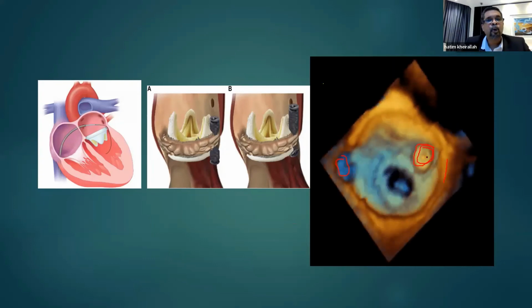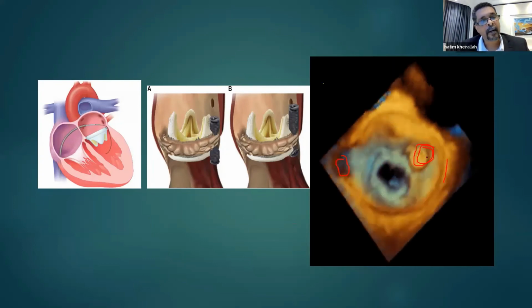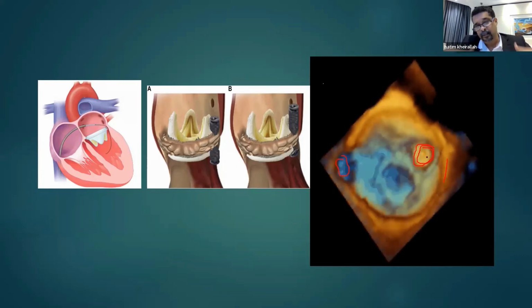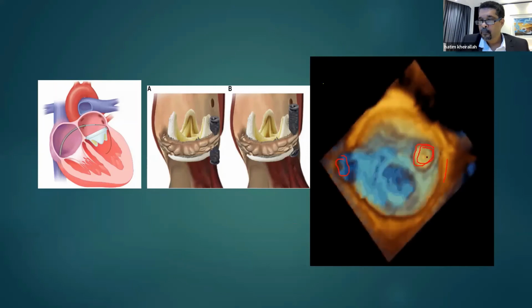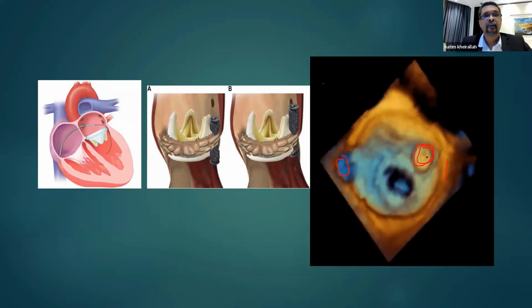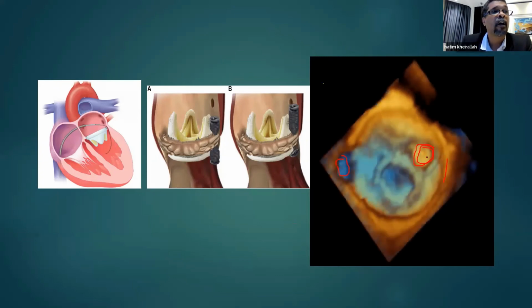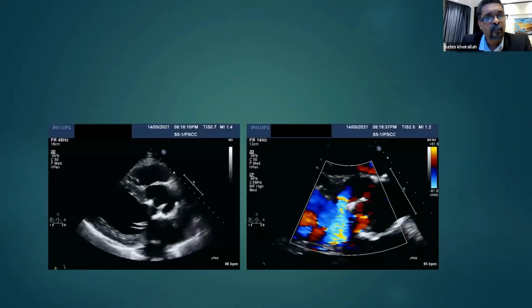So this is the scope and the landscape of structural heart disease. Mitral clip, of course TAVI is taking off so high. TAVI is one. Mitral clip, tricuspid clip, valve in valve, and percutaneous closure. Okay. Last one is this one.